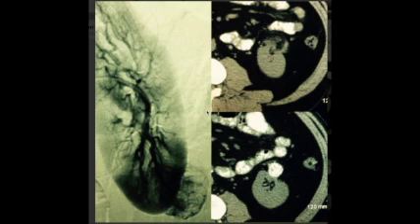So here's an example of an angiomyolipoma. This is what Mrs. Trump reportedly had. In the upper corner here, you can see this is a kidney. It's a CAT scan, and there's fat within it. We know it's fat because fat is dark, just like this fat around the kidney. And then the rest of the material is blood vessels and other solid tissue.